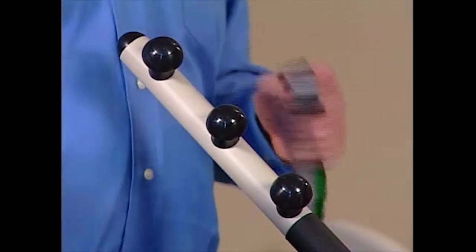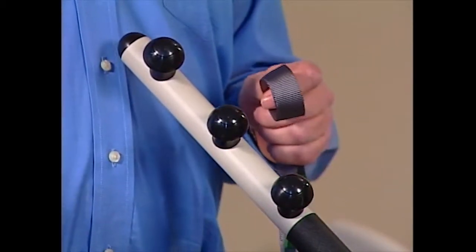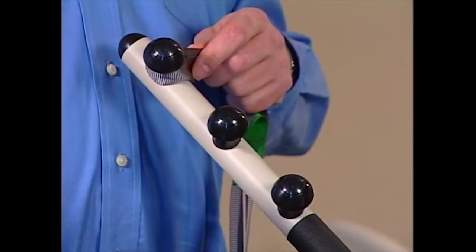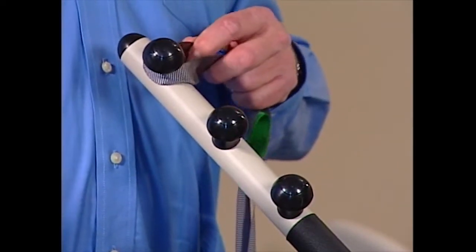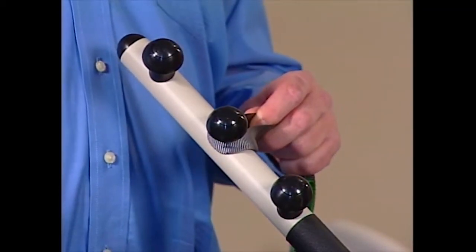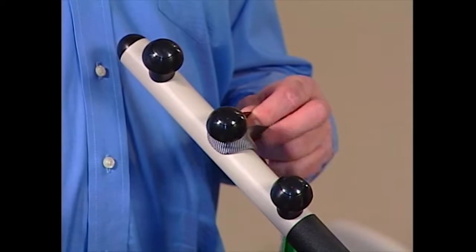The sling secures onto one of three knobs. If you're lifting a tall person — someone over five feet ten — use the knobs on the end. If you're lifting a person of medium height — someone between five-six and five-ten — use the knobs in the middle. And if you're lifting a shorter person — someone five-six or shorter — use the knobs closest to the mast.